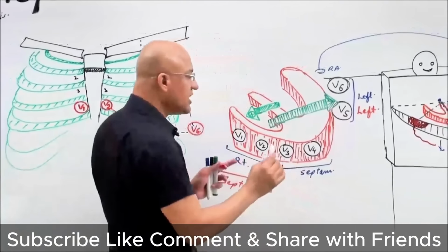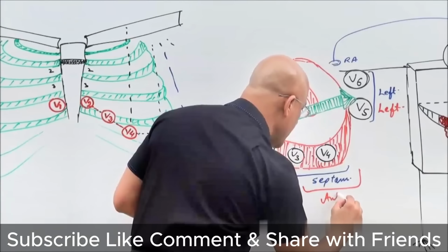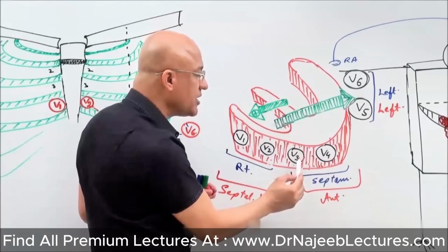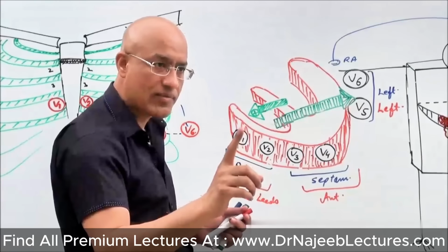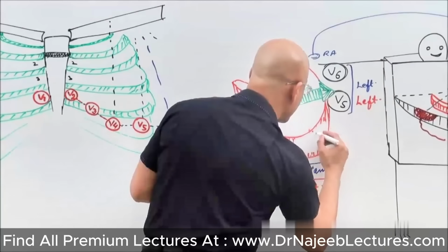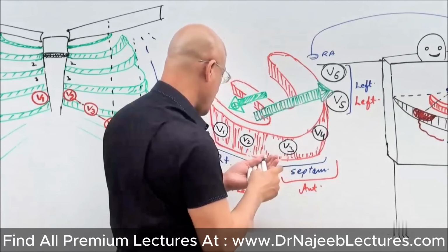And if there is strictly an anterior MI, a small anterior myocardial infarction, that will show changes of infarction in V3 and V4. Is that clear? I have to put it a little more laterally. V4 should come here and V3 should come here. Okay.